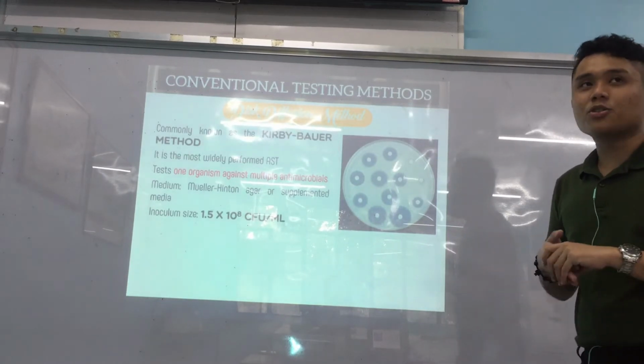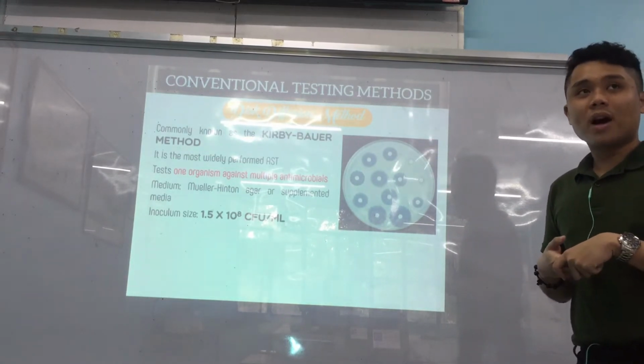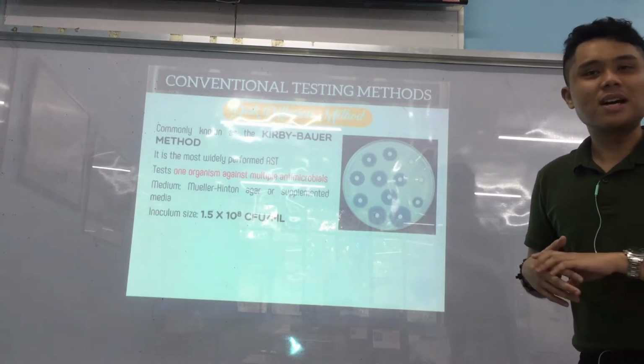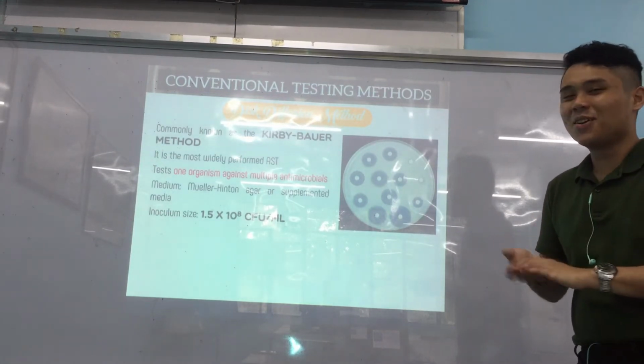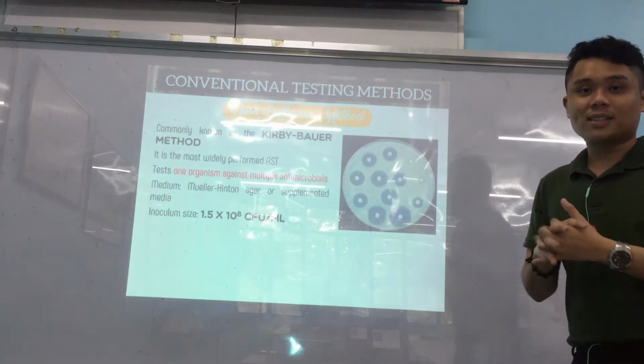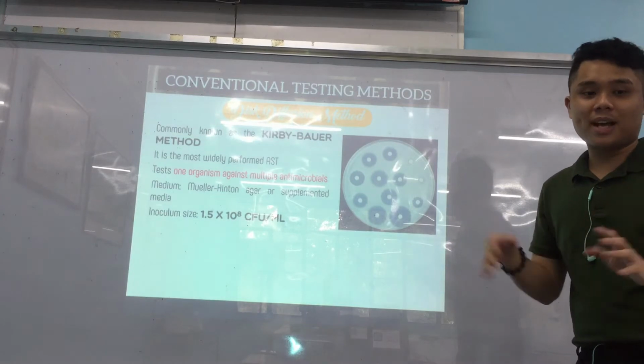So it's like 99.5 ml of 1% sulfuric acid and then 0.5 ml of 1.175% barium chloride, if I'm not mistaken. I'm a bit mixed up right now, but please try your best to master that, because it comes out in the boards or in your exams.